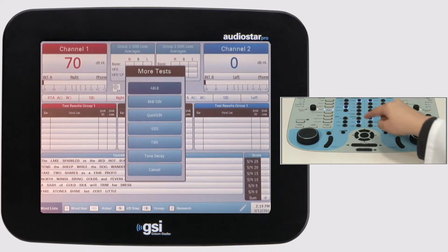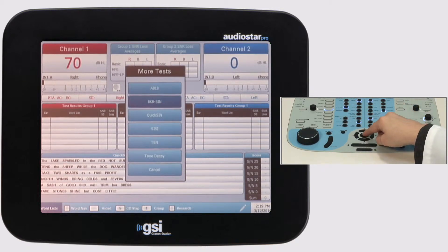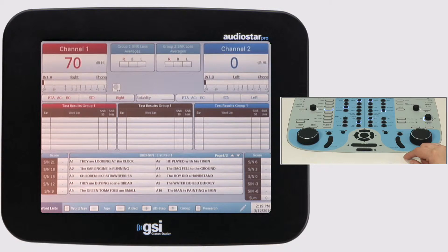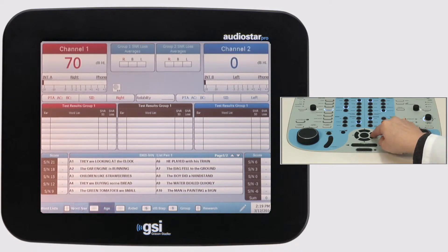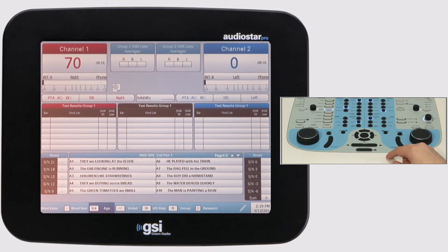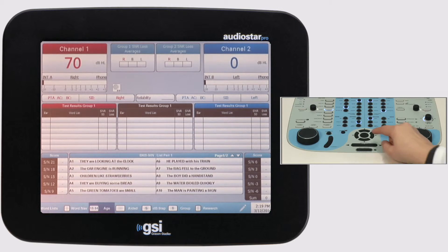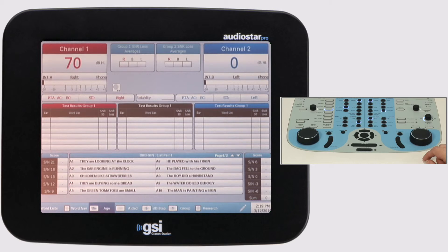To access the BKB-SIN, press the More Test Type button and select the test. The BKB-SIN sentence material is easier and is appropriate for testing children from ages 5 to 14, cochlear implant patients, as well as adults that struggle with the more difficult QuickSIN sentence material. The BKB-SIN normative data is integrated in the AudioStar Pro.